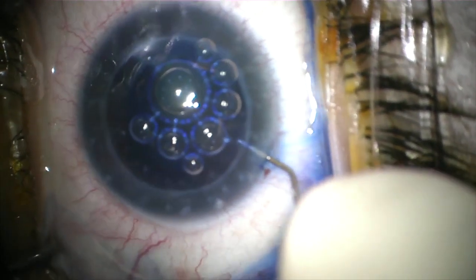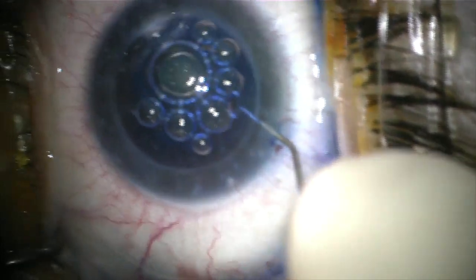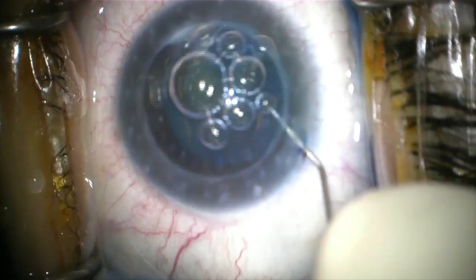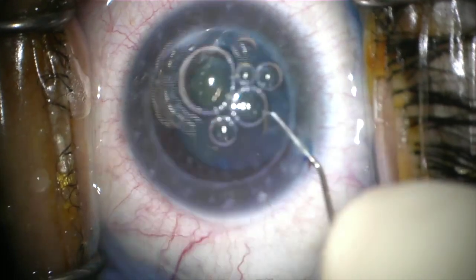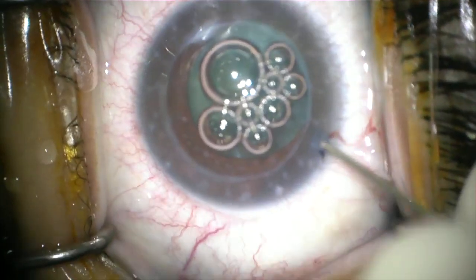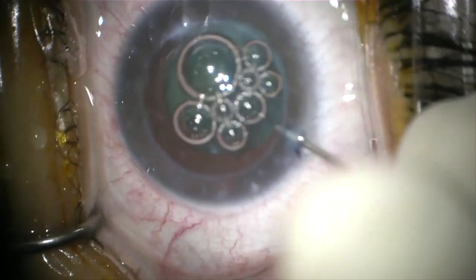I find that frequent topical balanced salt solution is really important to keep the epithelium well hydrated. I also like to use Trypan Blue in these cases because I find that it helps to aid in construction of my capsulorrhexis, because sometimes the edge of the graft can make visualization difficult in construction of your rhexis.